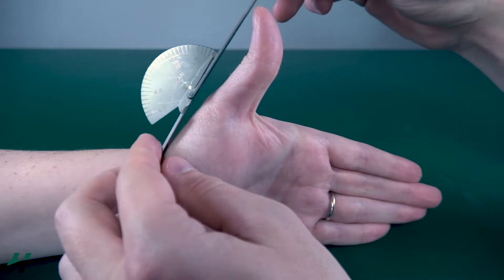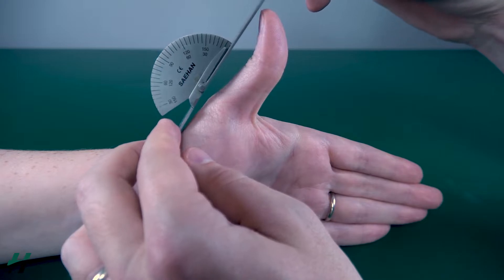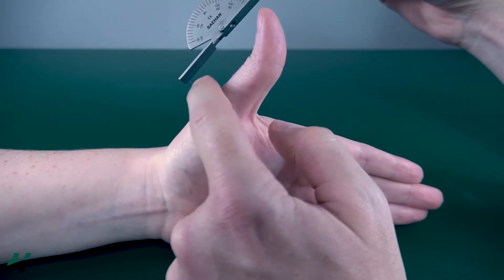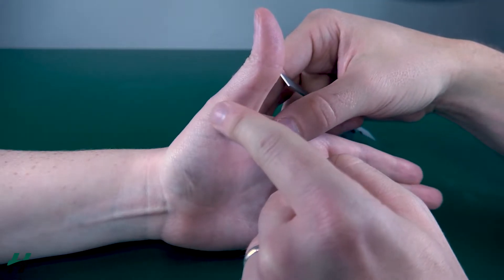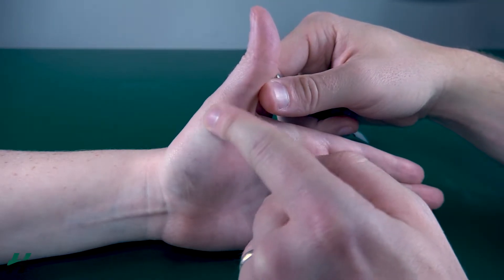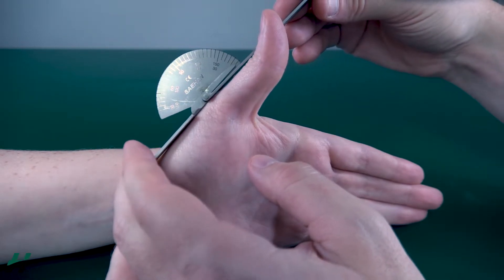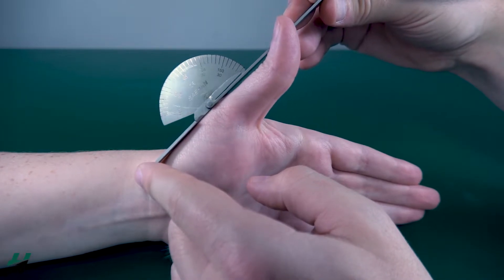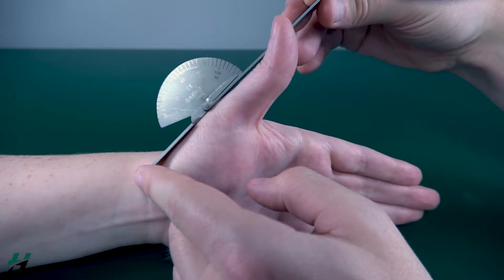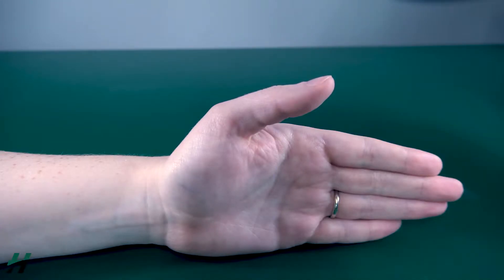As you can see, if I was to measure this on top of the thumb I would get a very inaccurate reading — negative or plus 20 degrees of hyperextension at this joint — but that's clearly not the case at this MC joint itself. It's about zero degrees. If you want to measure it, just angle the goniometer a little bit off the thumb, and here we can see zero degrees of extension.